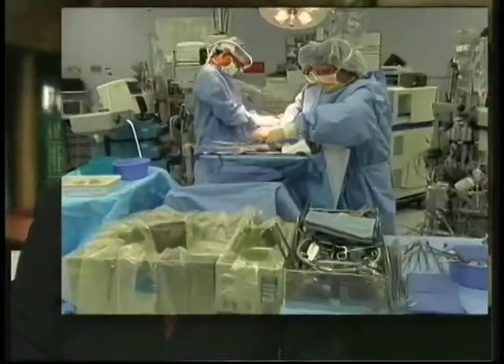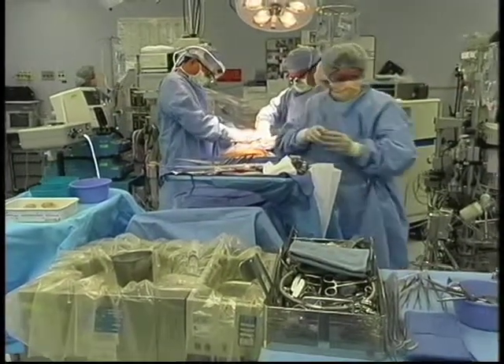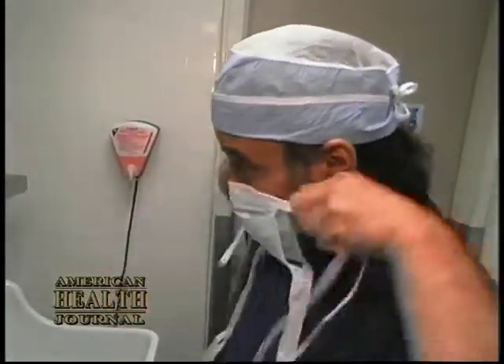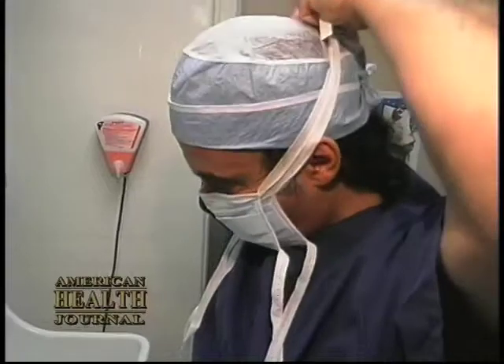In traditional coronary artery bypass surgery, the heart is stopped with a heart-lung machine used to circulate and oxygenate the blood. Now off-pump surgery is being done without stopping the heart. As Dr. Carlos Blanche of St. Jude Medical Center in Fullerton tells us, patients experience faster recovery by the use of this procedure.